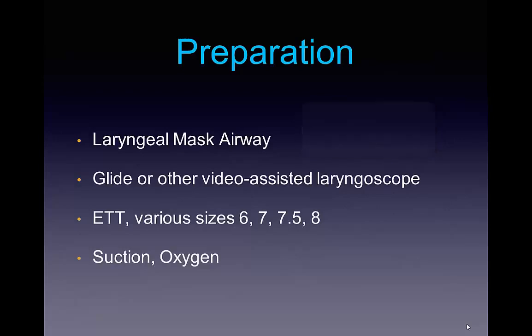Having a laryngeal mask airway is critical, as we've spoken about previously in this podcast, for oxygenation, and you should be familiar with the use of laryngeal mask airways, and we'll cover this again in a different topic. Laryngeal mask airways are a good adjunct to oxygenation. They can be inserted fairly easily, and they come in various sizes, with size 4 and 5 being standard sizes, and can be used to pre-oxygenate the patient or deliver an airway in the case that an endotracheal tube cannot be delivered.